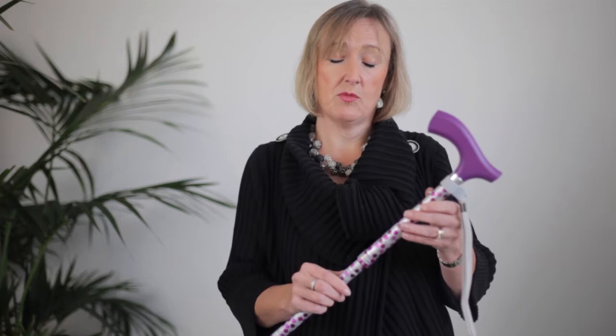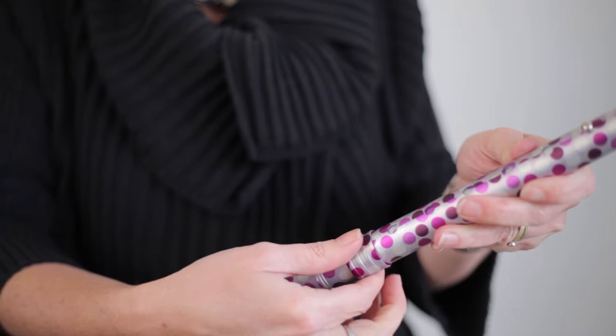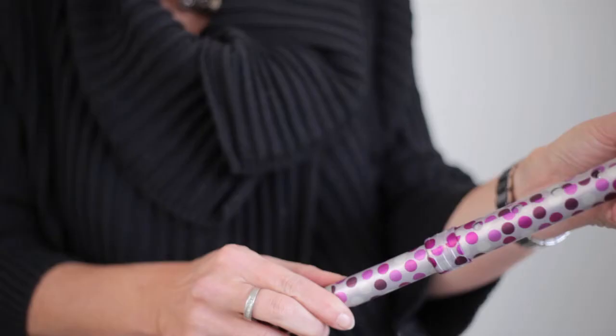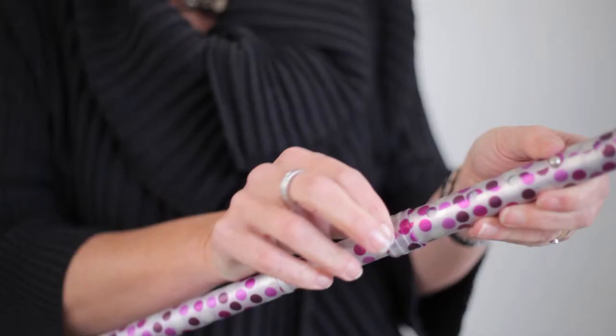The walking stick has to be at the right height, so how do you adjust the height? Very simple. The stick adjusts from 32 to 37 inches in 1-inch increments. All you do is loosen the safety locking band — give it a half turn. Once that's loose, you pop the pin in and put it to whatever height you need it to be. You can hear it clicking as you adjust.